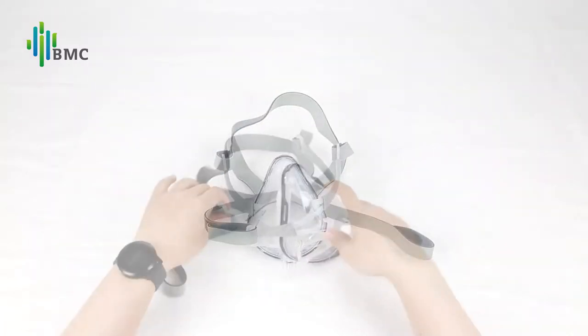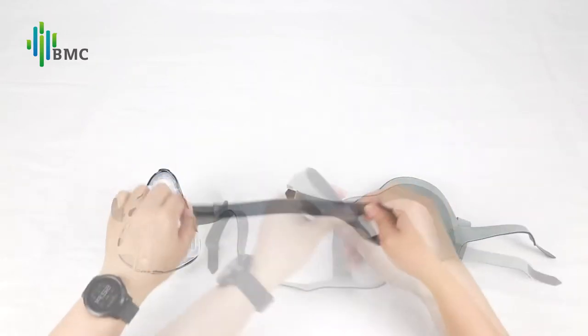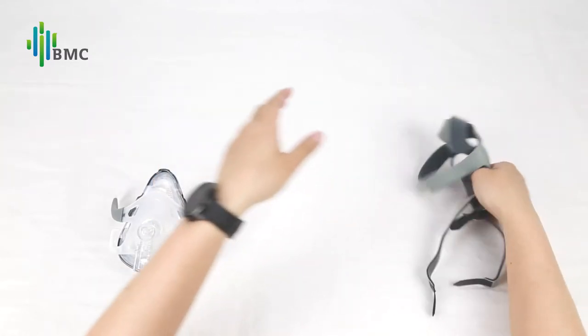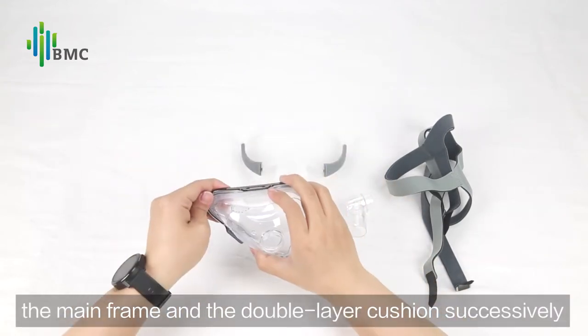Mask Disassembly: tear the adhesive tips of the headgear and separate the headgear from the mask. Then take off the elbow, the headgear frame, the mainframe, and the double layer cushion successively.